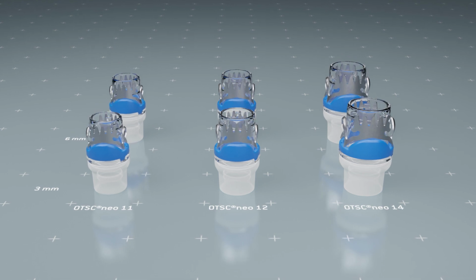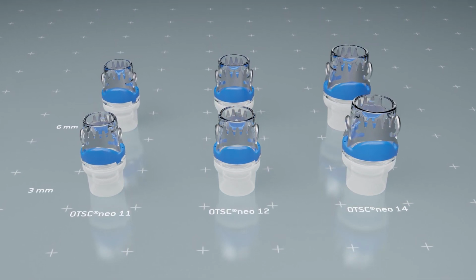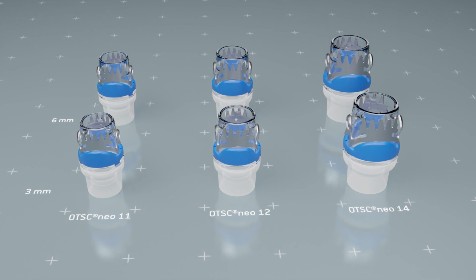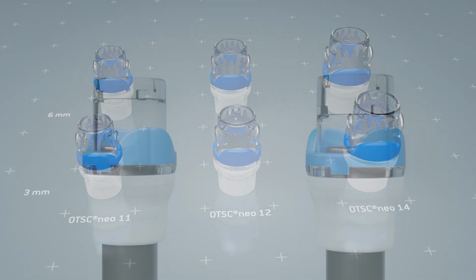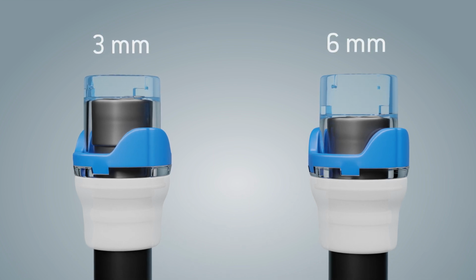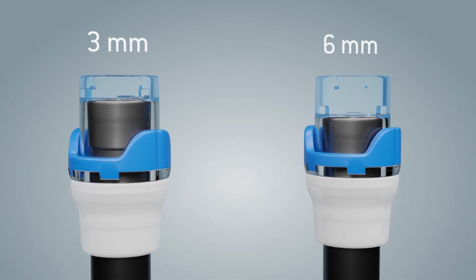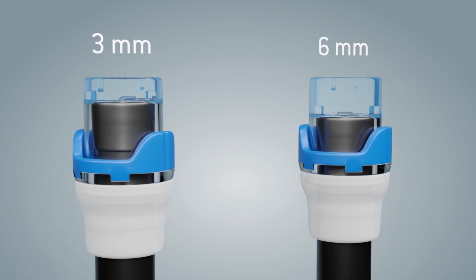The clips are mounted on matching OTSC Neo application caps. The caps are available in system sizes 11, 12, and 14. All 3 sizes are available with a cap depth of 3 or 6 millimeters. The appropriate clip type and system size are selected by the user and depend on the requirements of the respective procedure.